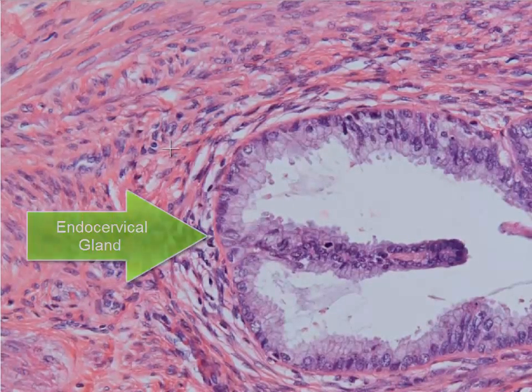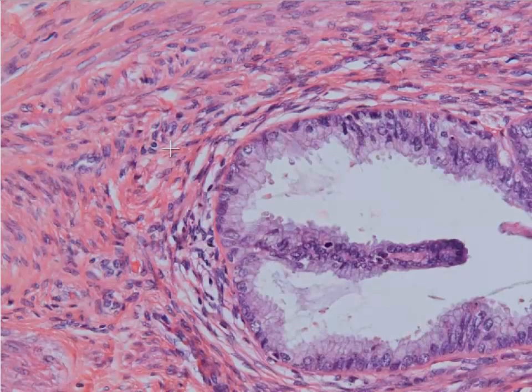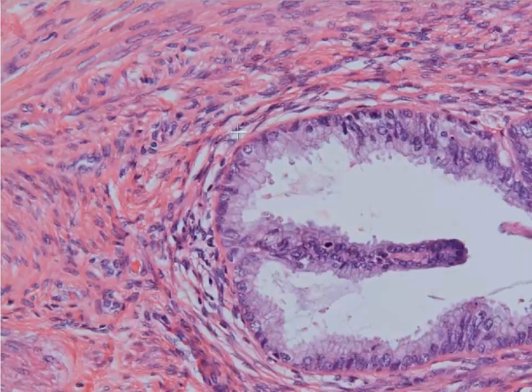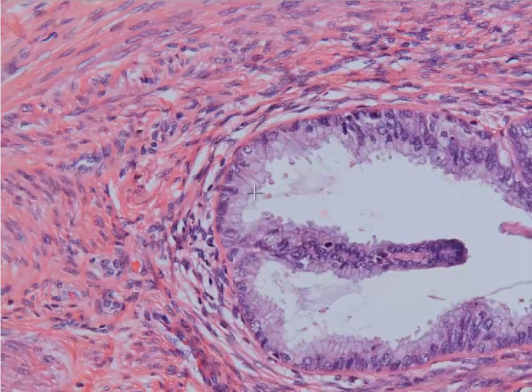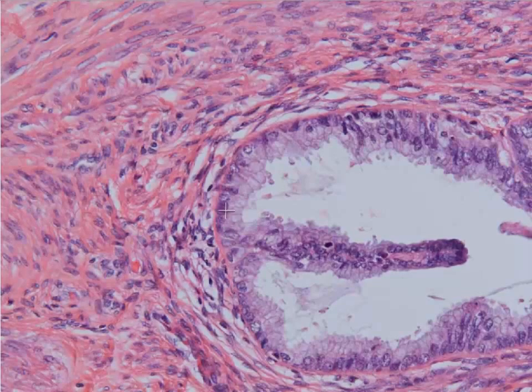You guys know all about the squamous dysplasia that can happen in the cervix. Well, HPV 16 and 18 also can infect the glandular cells. What you see here is actually a normal gland — at least half of it is. If you look at the part on the left, this is normal endocervical glandular type mucosa, and you can see there's a lot of ample pale blue cytoplasm.